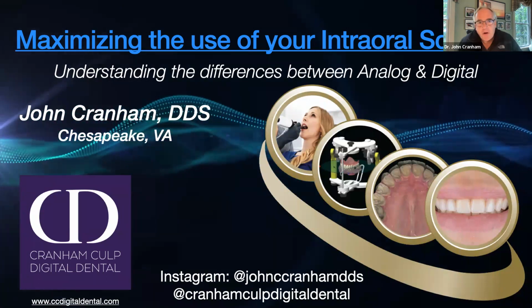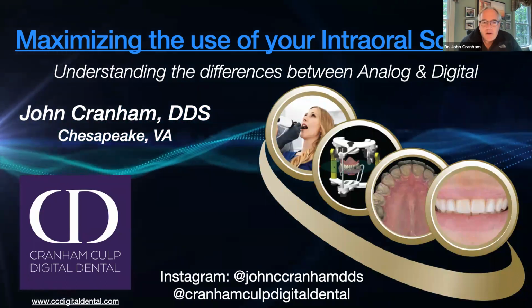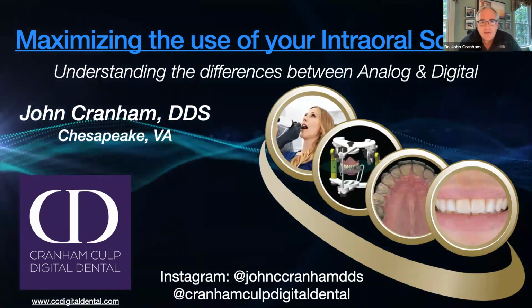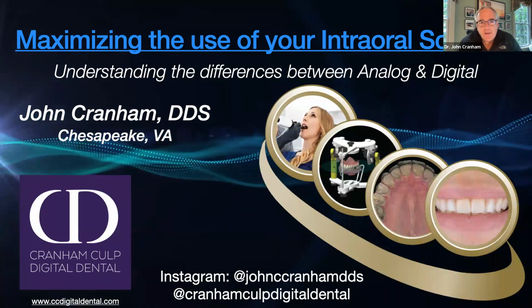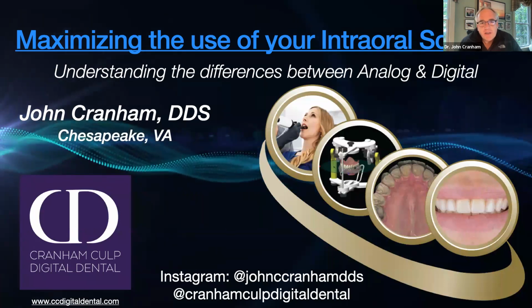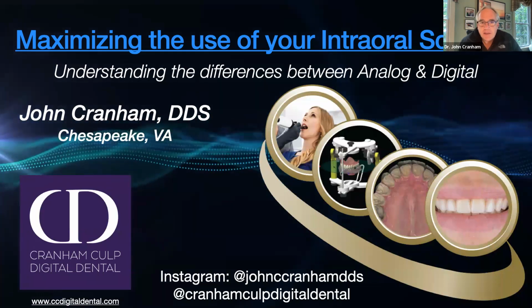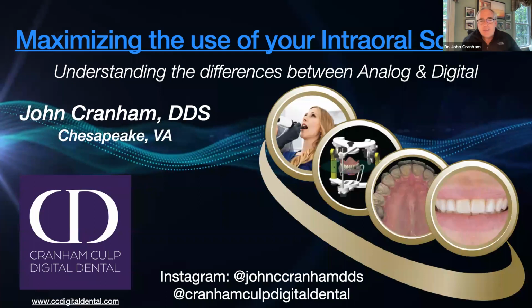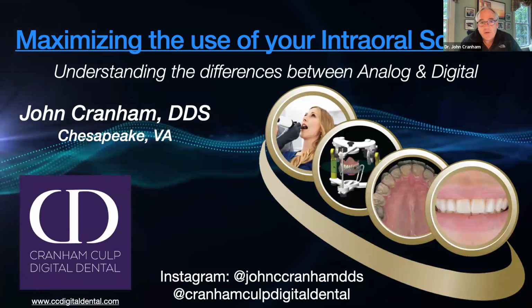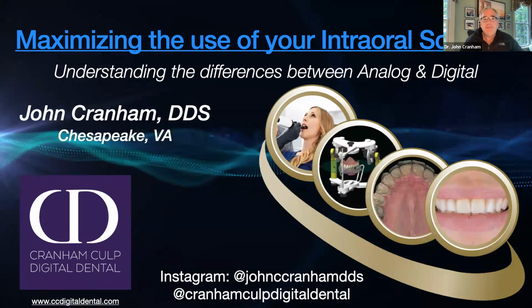I think it's appropriate for us to have a discussion about scanning, because I do think that's where it all begins. Most people today have a belief in this technology. There are a lot of different options out there that can get confusing, but they all work pretty well. One thing I want to reiterate is that scanning is the place where the data begins. It's where we start getting that mesh of the mouth that we can do so many things with, whether it's planning a case or doing crown and bridge or veneers or partial frameworks or even digital dentures today.